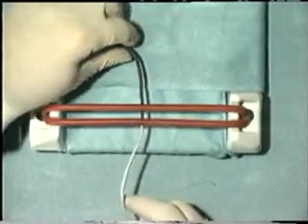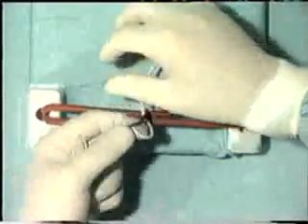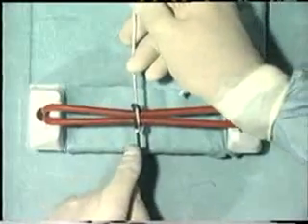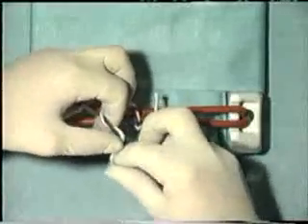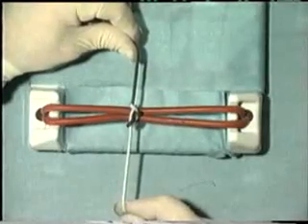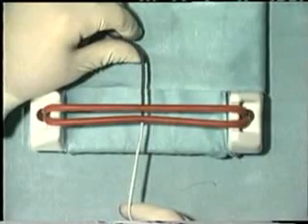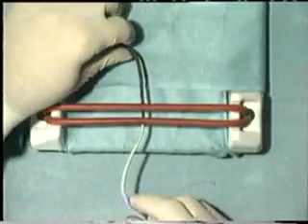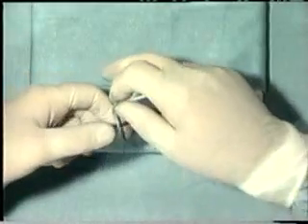Occasionally, we want a knot which is secure and will not slip even with one throw. Therefore, we can tie 2 throws, as seen here, and snug that down, and then return by 2 more throws. And although we don't have a very pretty looking knot, we have a very secure surgeon's knot. Let's tie this now once more in slow motion. Take the threads and cast the first throw of the reef knot, and then take the thread through once more.